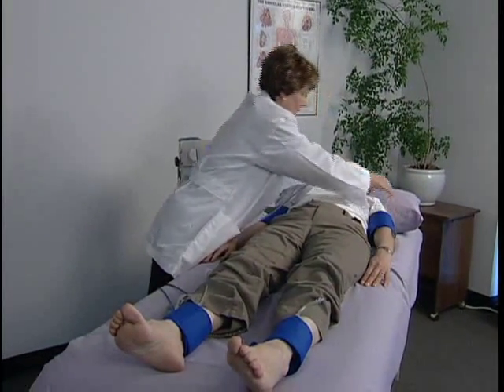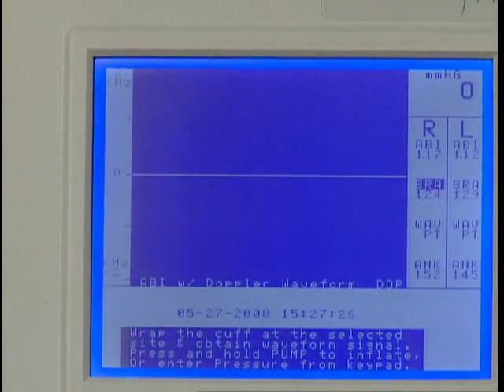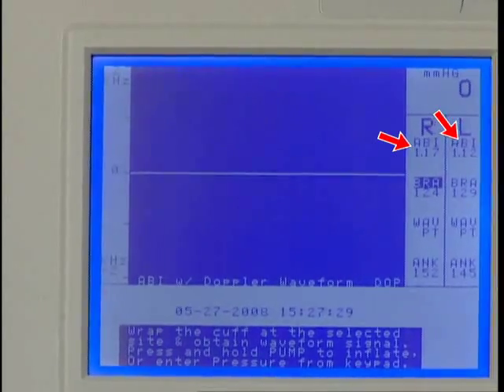Switch the hose to the cuff at the left brachial and obtain the pressure. After saving the pressure, the marker will move back to the right brachial location. At the end of the exam, the ABI results are calculated automatically.